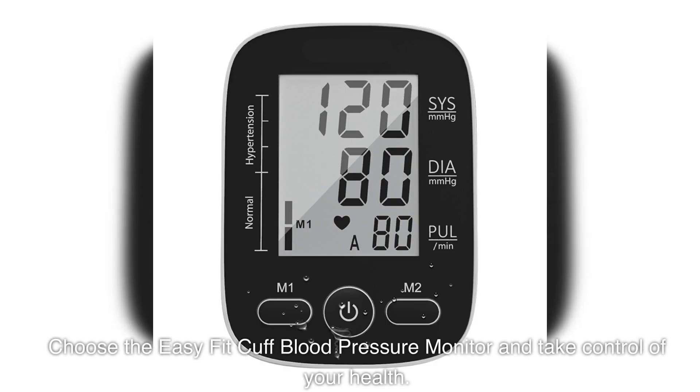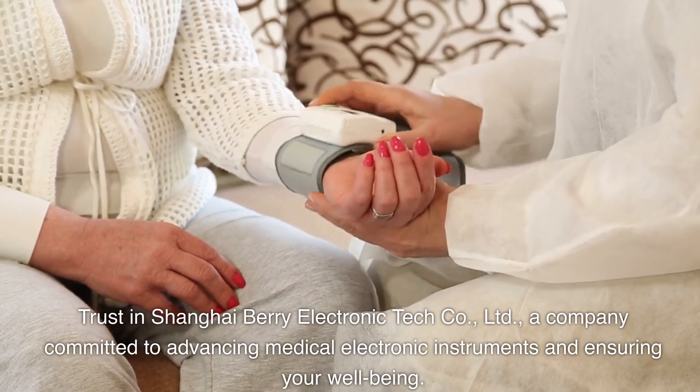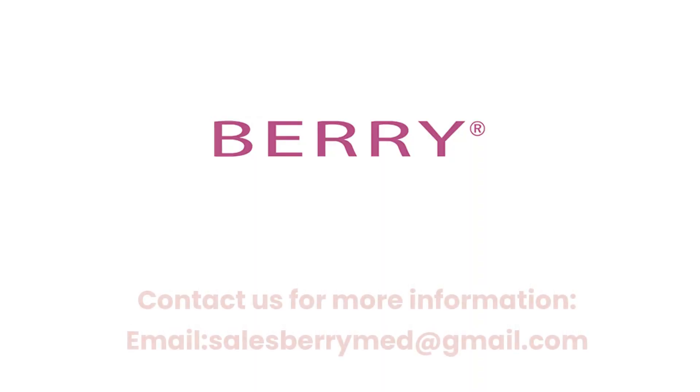Choose the EasyFit Cuff Blood Pressure Monitor and take control of your health. Trust in Shanghai Berry Electronic Tech Company, Limited — a company committed to advancing medical electronic instruments and ensuring your well-being. Contact us for more information. Email: salesberrymed@gmail.com.